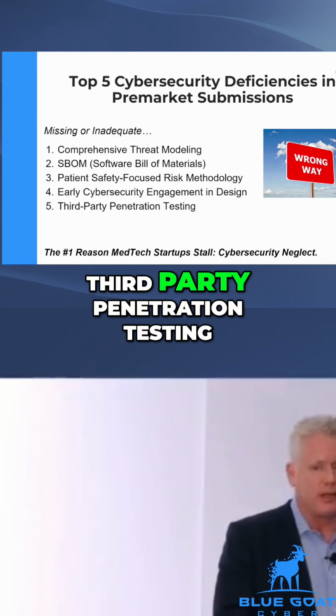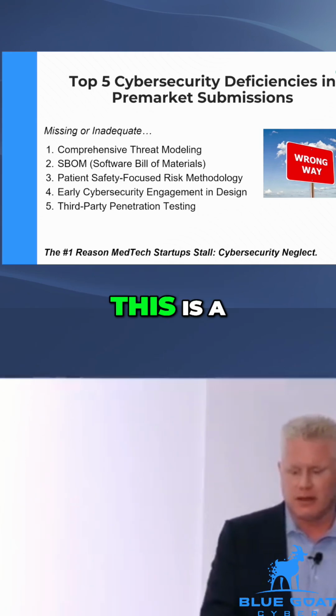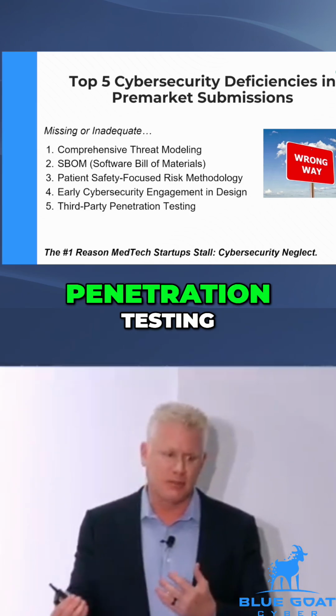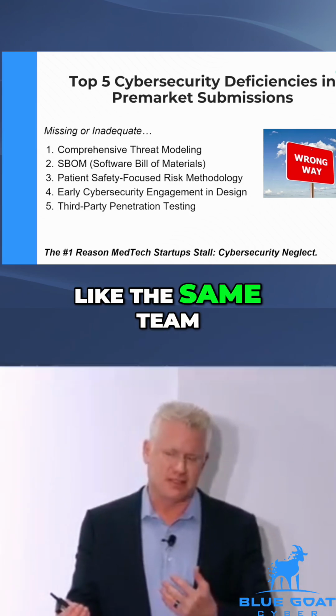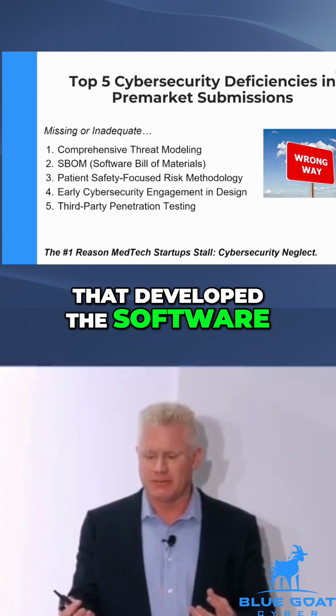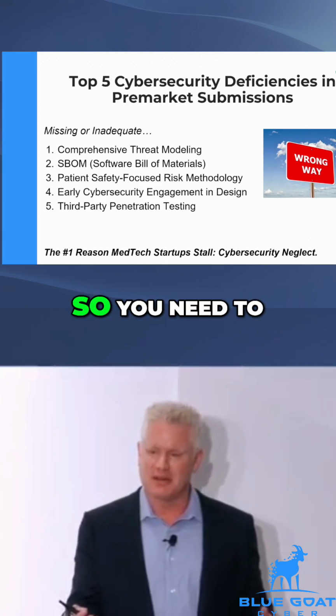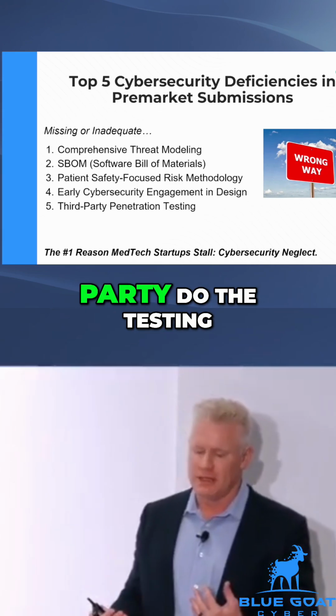The other part is third-party penetration testing. This is a mandatory thing that needs to be done. A lot of people try to do internal penetration testing, like the same team that developed the software tests the software. Obviously, that's not a good way of doing things. So you need to have an independent third party do the testing.